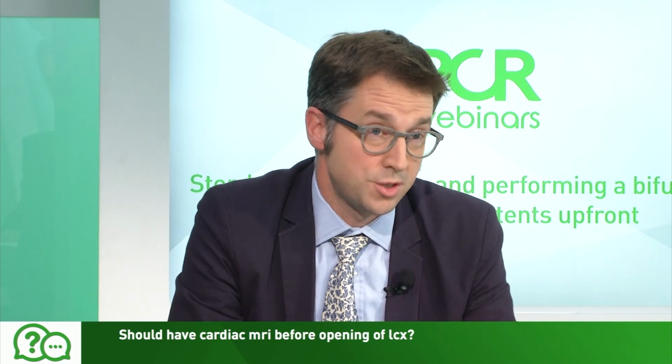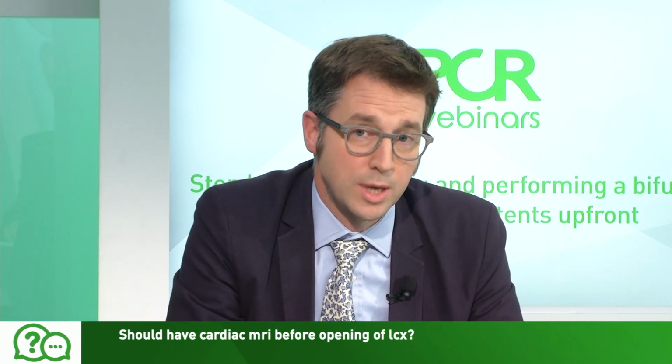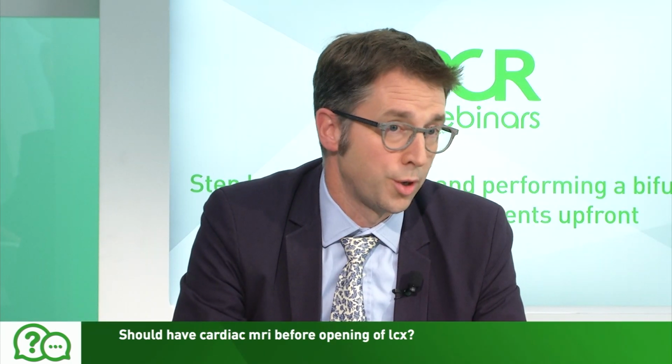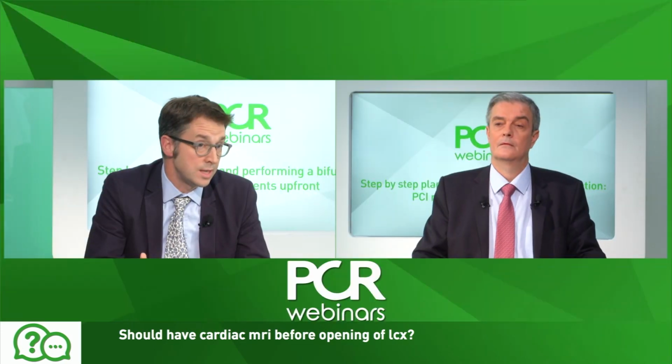So absolutely my strategy did change, and you can see that there's kind of an evolution of decision making. I became increasingly fearful of losing those branches. And so Maciej has already highlighted the benefit of DK crush in protecting your branches. I have to say I shifted at this point to undertaking this as a DK strategy. Yeah. So the main difference is actually whether you start by stenting side branch or main branch first, which one you want to preserve. Yeah.